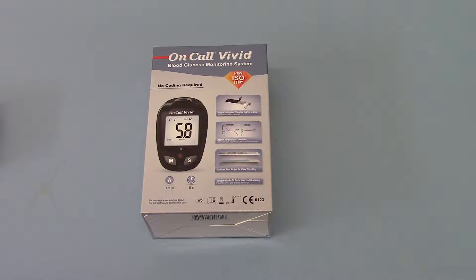This unit is one of the few units to meet the new ISO 15197 standards. That basically means the accuracy of the tests within the parameters have to be very precise. There are very few meters on the market today which have actually met those standards, and the OnCall Vivid is one of them.